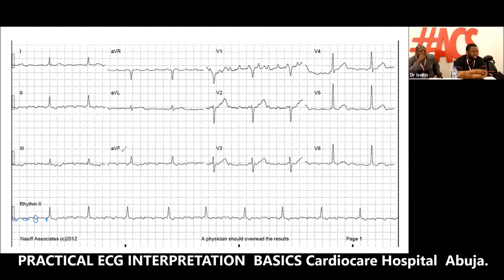Okay, there is no ST segment depression or elevation, right? Maybe in 2, 3 and aVF, very slightly, but so small. It's not quite significant, but it's something to look at. No depression, no elevation, right? Any other thing? Is there right ventricular hypertrophy? No. Remember, right ventricular hypertrophy is a positive QRS complex in V1. Is there LVH? Look at V2. V2 is 2 boxes. V5 is 3 boxes. It makes 5, not 7. So no. All right, great. Next ECG.